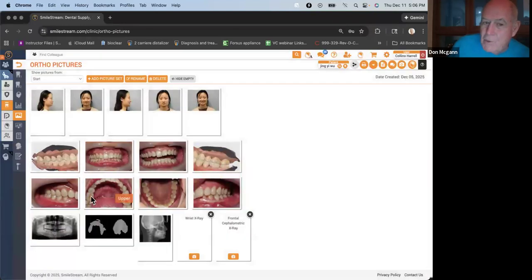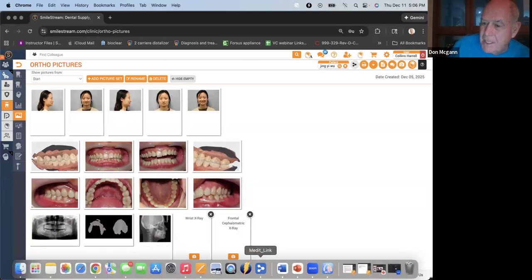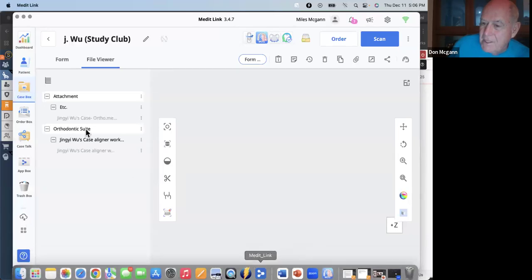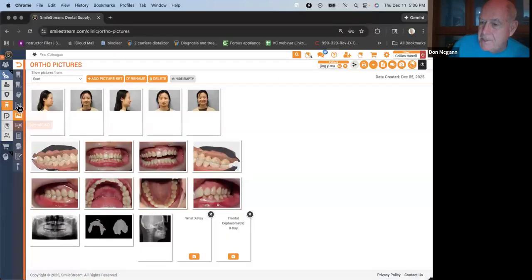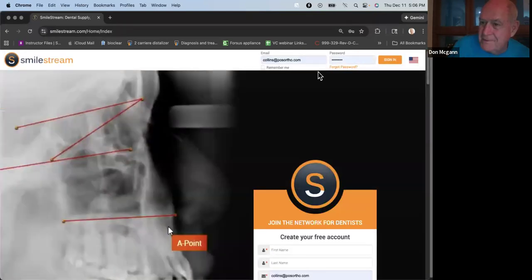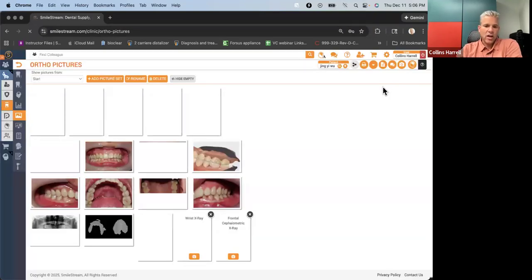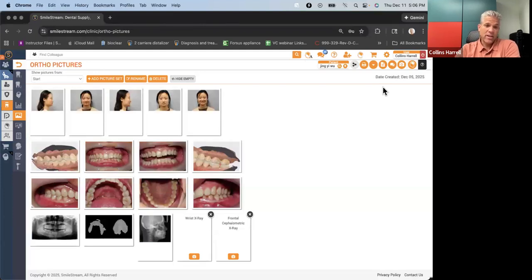So I don't know what the width was on that, but you might want to retrocline the upper incisor a little bit, and you're going to procline the lower incisor to reduce the overjet and accept some posterior class 2. I agree with that. So when you finally do get to the aligner setup, I'd probably give it a shot on my first set of aligners to try to fix the class 2. But then once you go through your first set of aligners, you're going to accept whatever you got. You're not going to get a full class 2 correction.